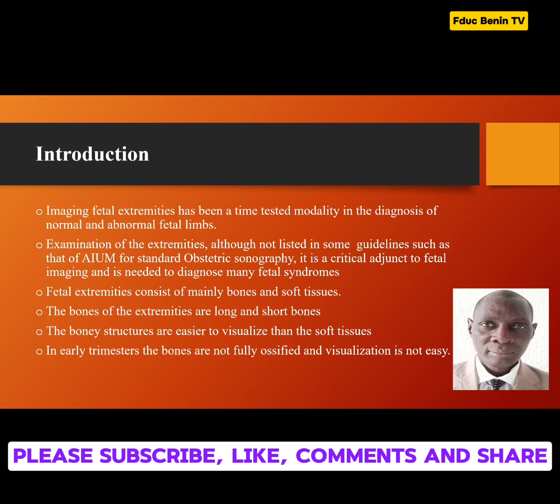Now, imaging fetal extremities has been a time-tested modality in the diagnosis of the normal and abnormal fetal limbs. An examination of the extremities, although not listed in some guidelines such as the American Institute of Ultrasound in Medicine for standard obstetric sonography, is however a critical adjunct to fetal imaging and is needed to diagnose many fetal syndromes.